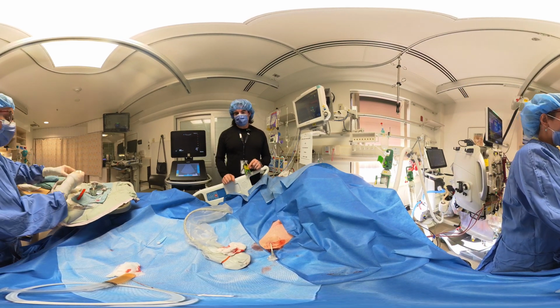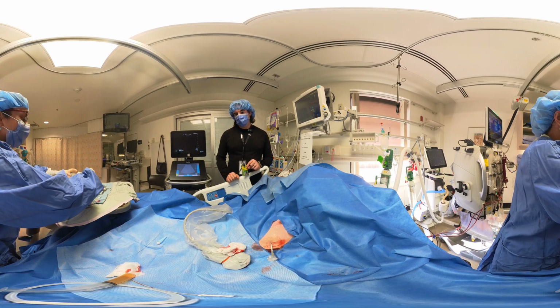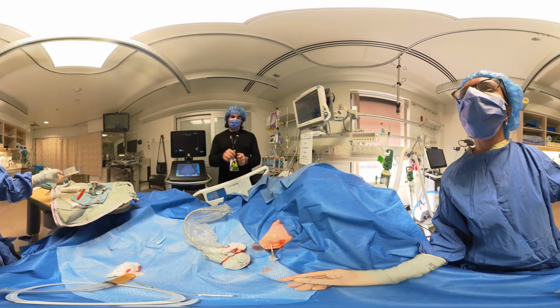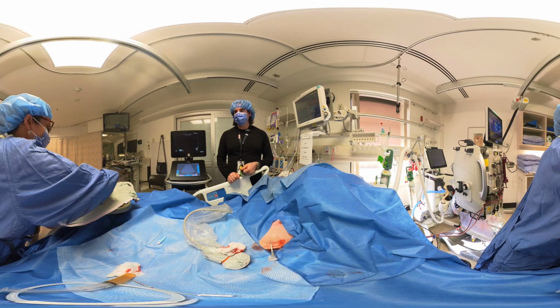Yeah, we have some Kellys there, or some needle drivers there too. Because it'll be around this? So suture to the skin first. Okay. So throw a loop to the skin first and then around the tube. Okay. Yeah, I'll show you.